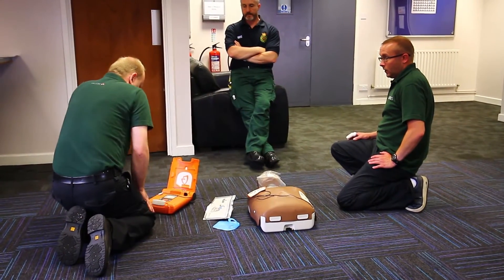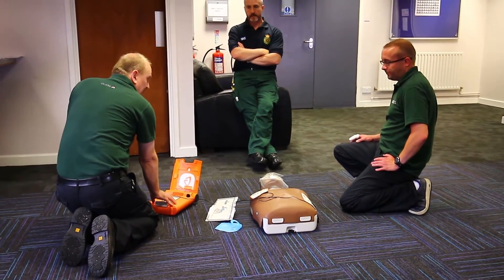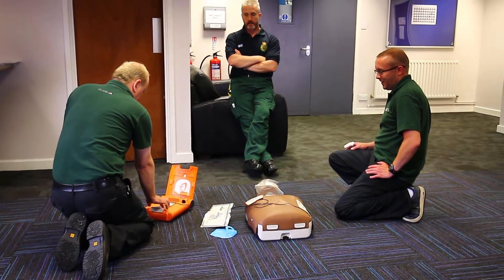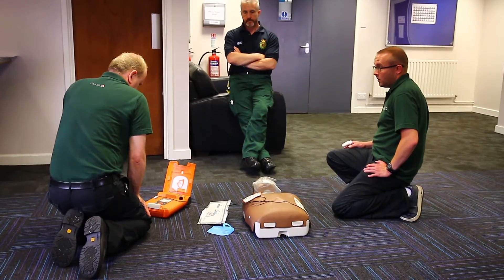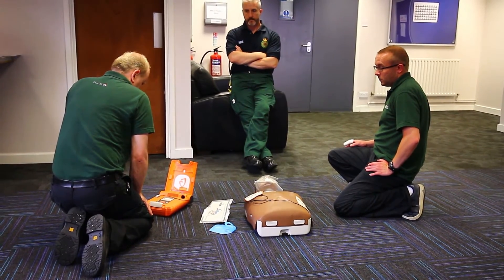Press red flashing button to deliver shock. Shock advised. Clear behind you. Clear behind me. Shock. Press red flashing button — shock delivered.